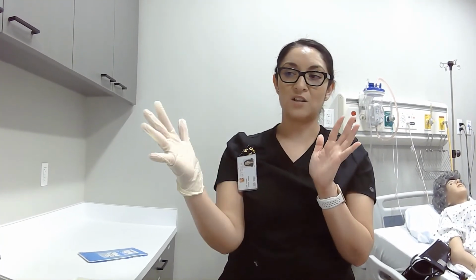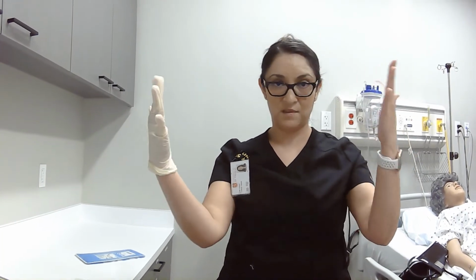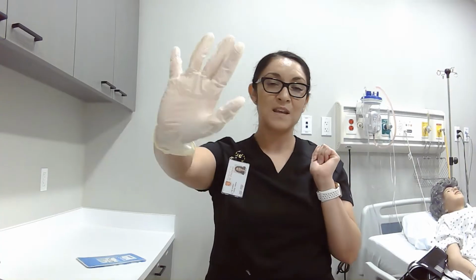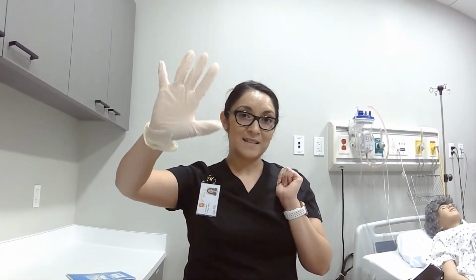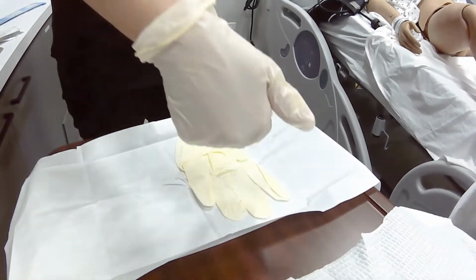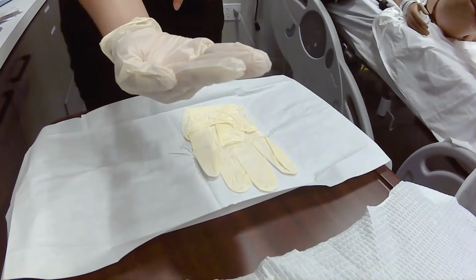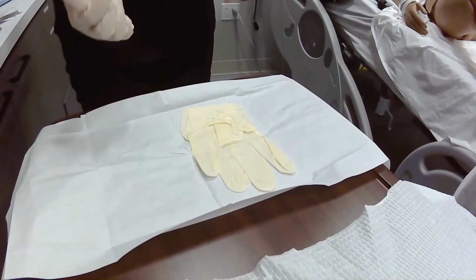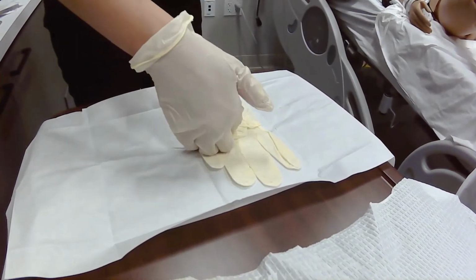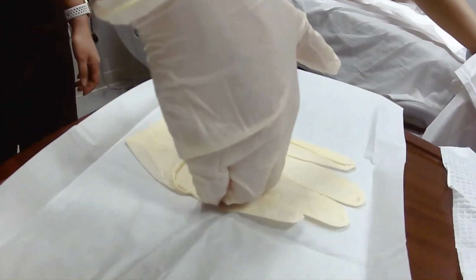Again, you can touch sterile to sterile and non-sterile to non-sterile, but not non-sterile to sterile, okay? So this hand is now sterile. So because my gloves are sterile and this part of the glove is sterile, I can touch sterile to sterile. I cannot touch this hand, sterile hand, to the non-sterile part of my glove, okay? So just keep that in mind so that way you don't confuse yourself.